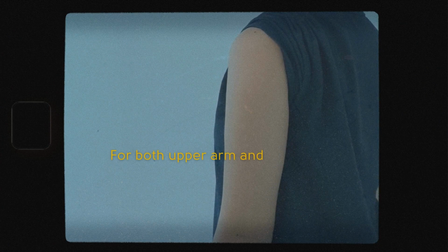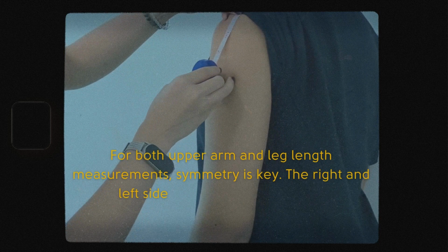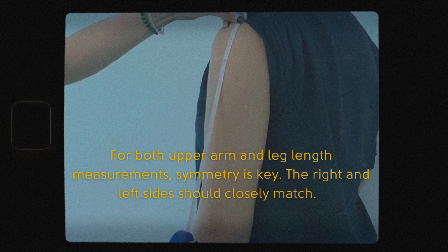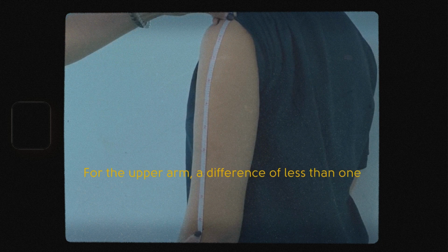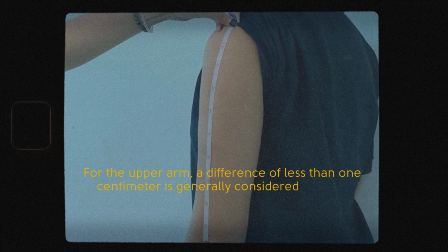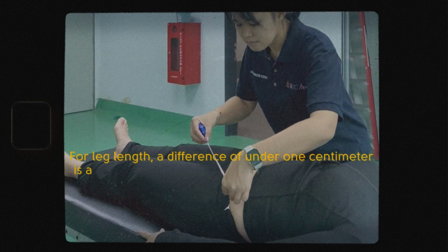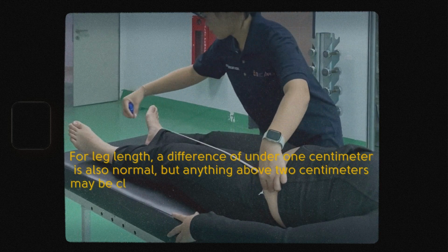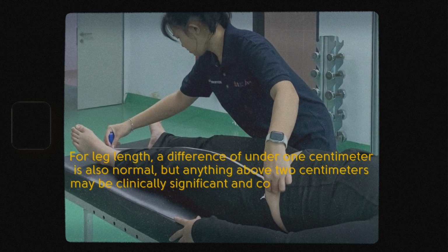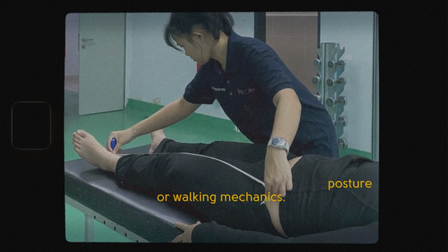For both upper arm and leg length measurements, symmetry is key. The right and left sides should closely match. For the upper arm, a difference of less than 1 cm is generally considered normal. For leg length, a difference of under 1 cm is also normal, but anything above 2 cm may be clinically significant and could affect posture or walking mechanics.